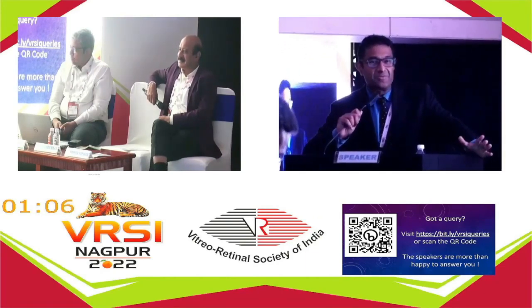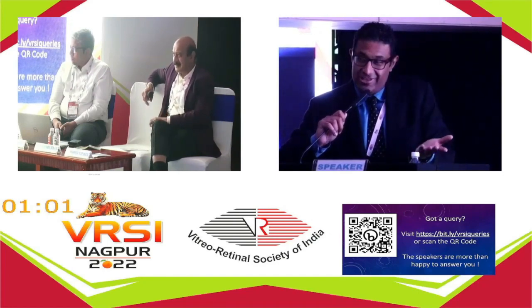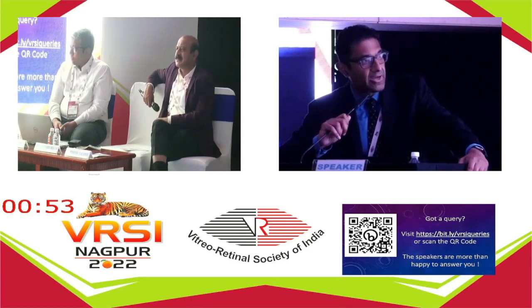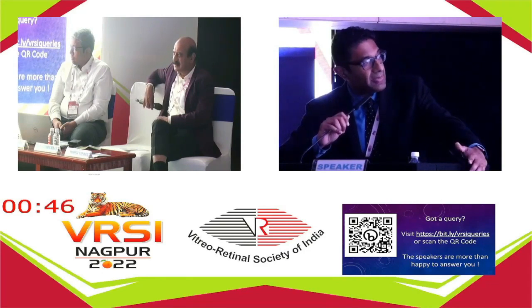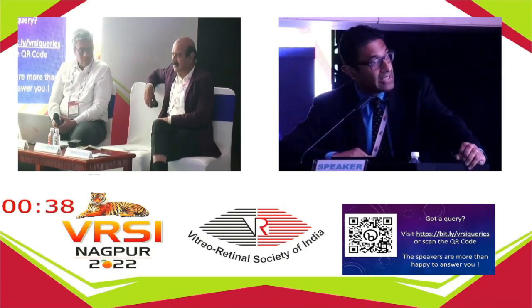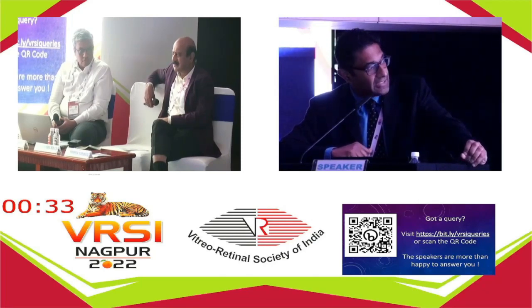Many times in debates, we're asked to argue points we don't believe in. In this case, I was actually happy to do this debate because it's a point I strongly believe in. I strongly hold the position that you need to have ultra-wide field imaging. I went through the cases relatively quickly because there's an additional concept that we all encounter: patients with no media opacity who dilate widely. Sure, you can get great imaging with your standard fundus camera, but that's not the reality in our clinical practice. We have many patients who dilate poorly. Patients have significant media opacity. And in those cases, it's invaluable.